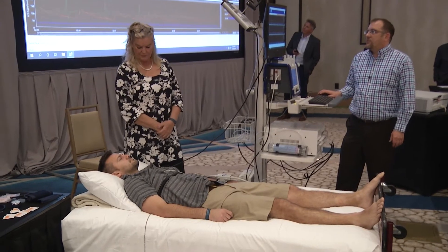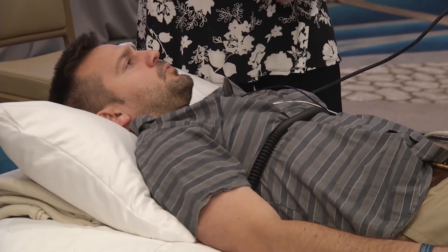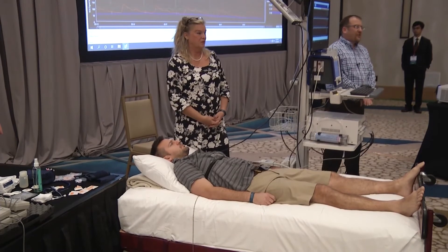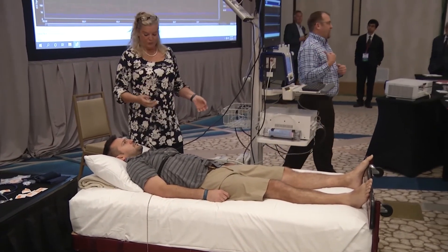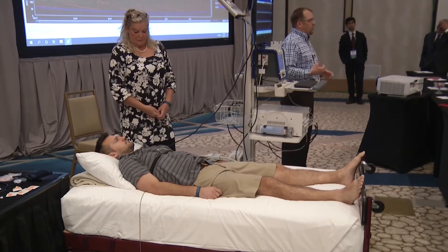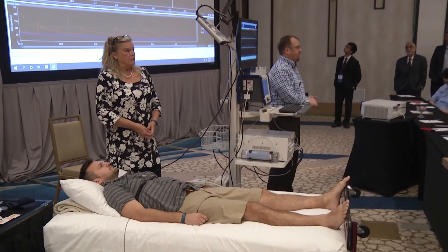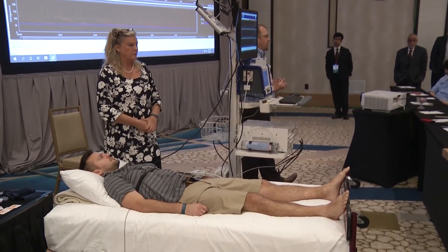Go ahead and take your big deep breath in, Jade. I like to do it with them and actually do all eight. It is extremely important that they are getting that maximal breath. If you're not coaching them and not paying attention, they'll wander off — they'll start out really good, and then by about breath five or six they start trailing off. So it's really important as a technician to watch each of those breaths and make sure they're getting that full breath.